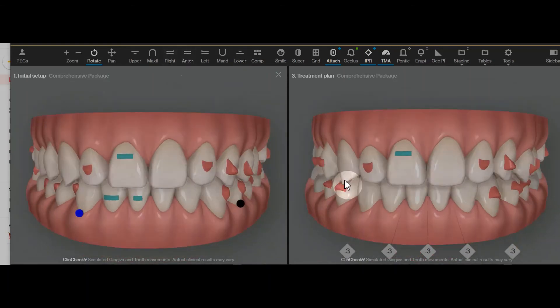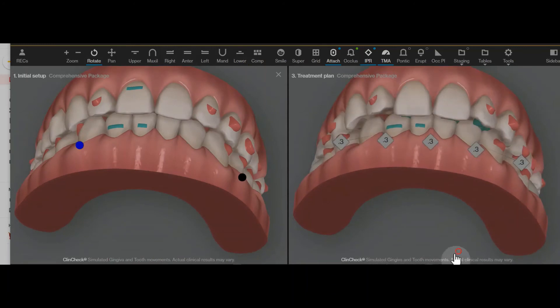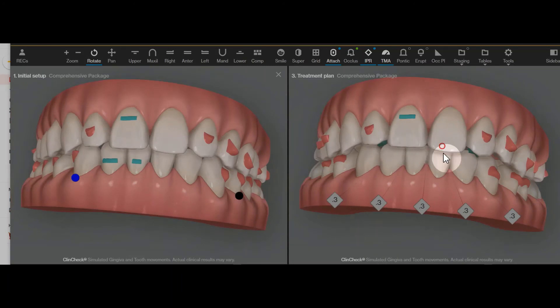What I have planned is bite ramps across the upper anterior to prevent molar passive intrusion as treatment goes along. The right side molars look like they're in a fine position right now, so there's no need to be moving those.